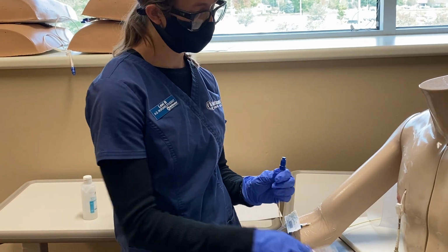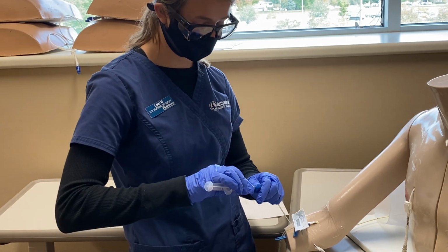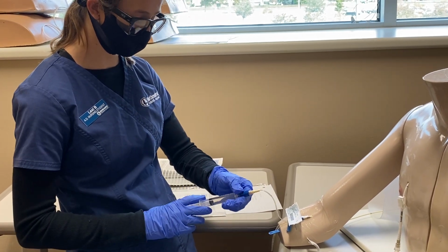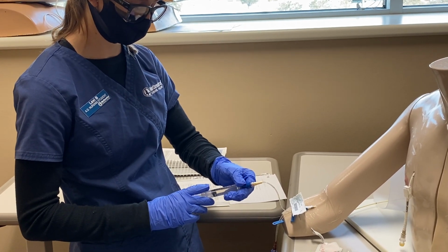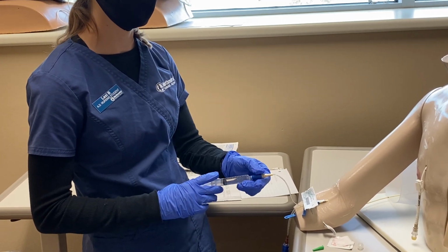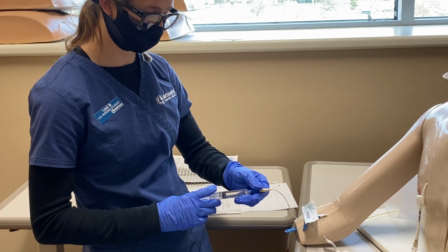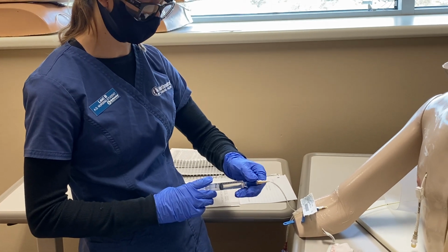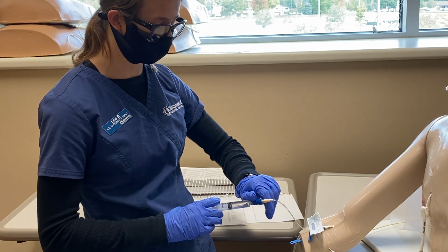Alright. Now this normal saline, I'm going to administer at the same rate as the medication was. So I'm going to be administering 1 milliliter for every 2 to 3 minutes. I'm doing this to make sure I'm flushing out the entire line and making sure no medication was left. I also have to do this for at least 5 milliliters, just to make sure that we got everything. Again, watching the time, and for purposes, just going to speed it up.